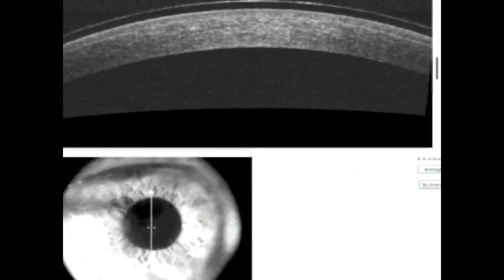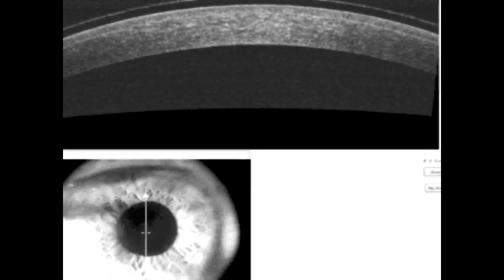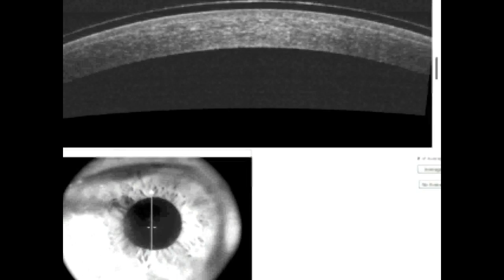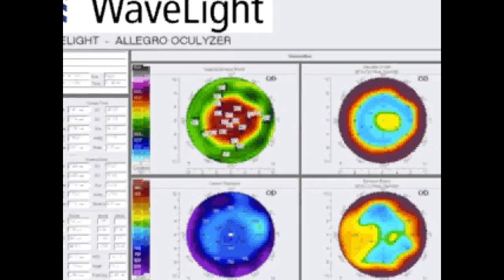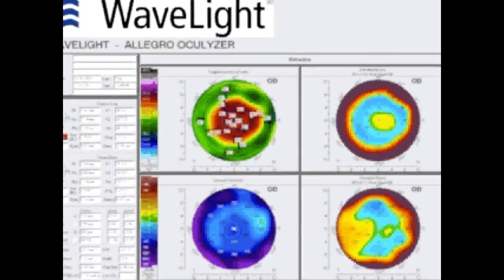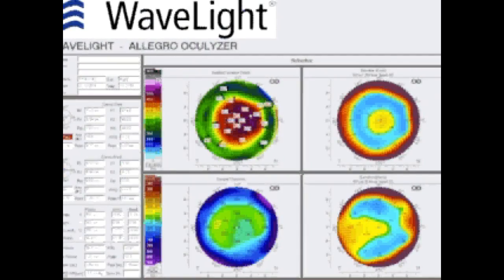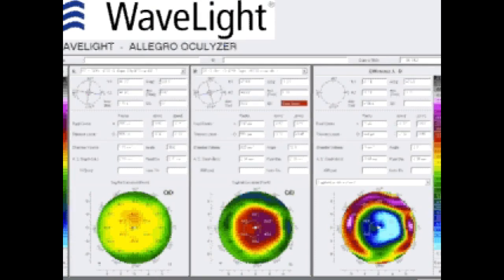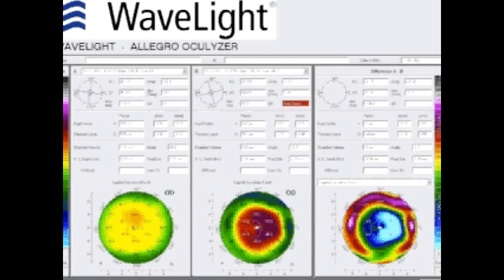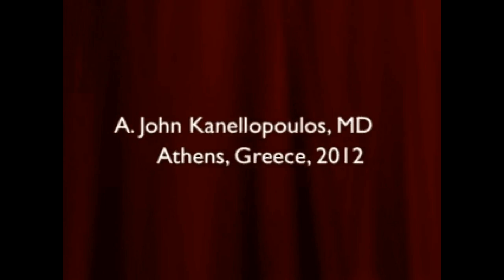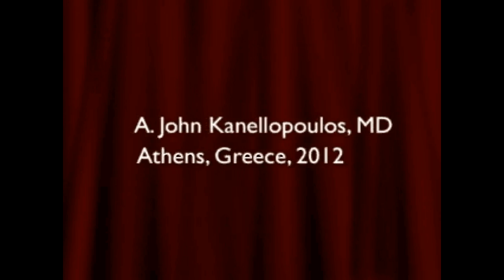This is the patient immediately after surgery — you can see the bandage lens and the hyperreflective interface. At one week and one month post-operatively, the refractive result is very stable: 20/20 uncorrected vision despite the high correction. On OCT several months later, you can see the hyperreflective interface depicting cross-linking. Here is before and after our current routine in hyperopia: topography-guided LASIK and prophylactic collagen cross-linking. Thank you very much for your attention.